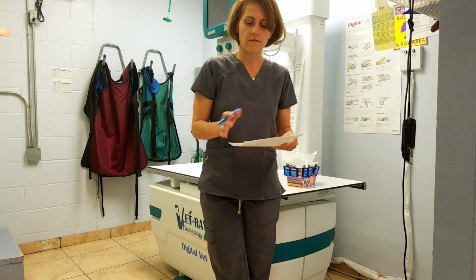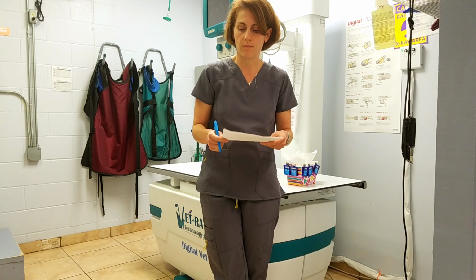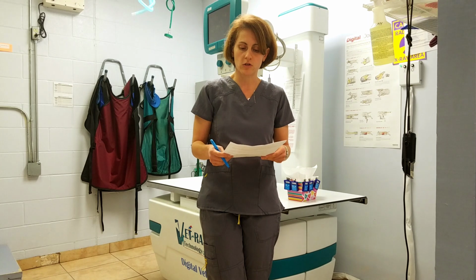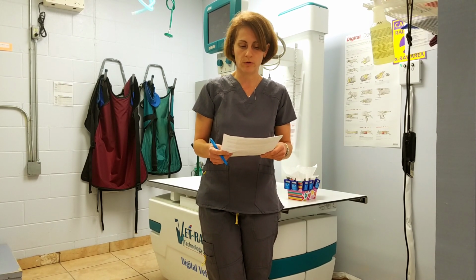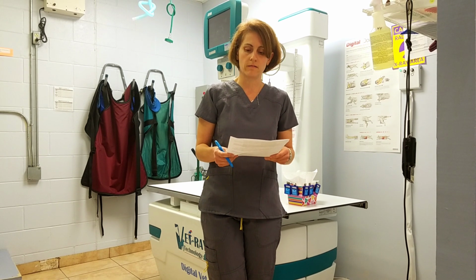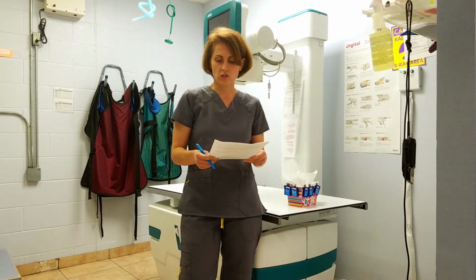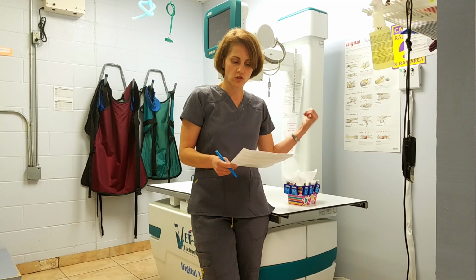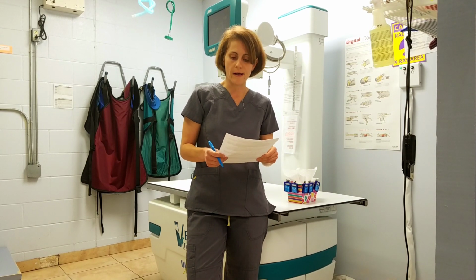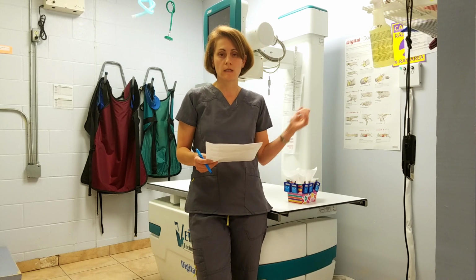So you should have the safety procedures, a copy of them that you can go over, you can keep for yourself. This manual establishes procedures to minimize radiation exposure and danger to employees. We have them so that we're in compliance with the Texas Department of State Health Services. Our x-ray facility is registered with that department. We have a certificate of registration. There are also rules that are posted that come from that organization. Those are also posted in here in radiology.